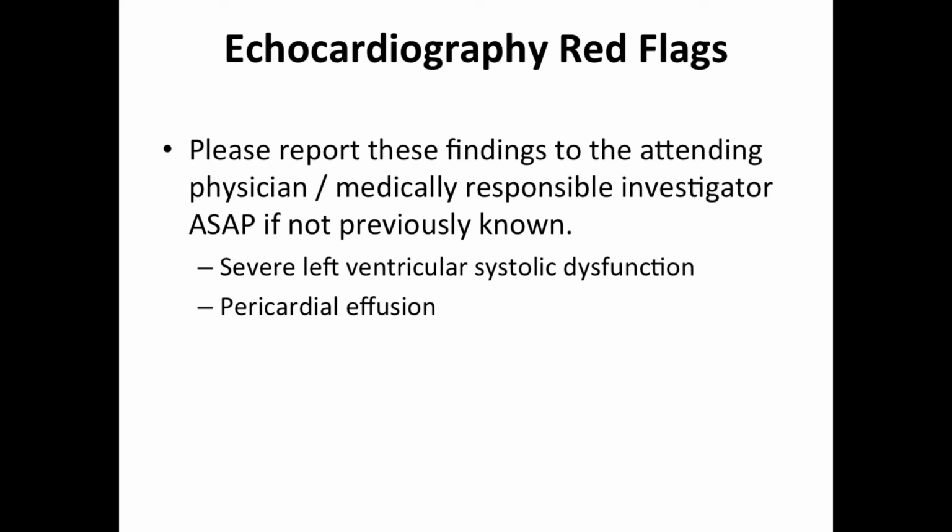While practicing echocardiography on research patients, it is possible to encounter some pathological states that need to be reported to the patient's attending physician. The two most important pathological states that need to be taken into account are severe left ventricular dysfunction, marked by an ejection fraction inferior to 30%, and pericardial effusion.